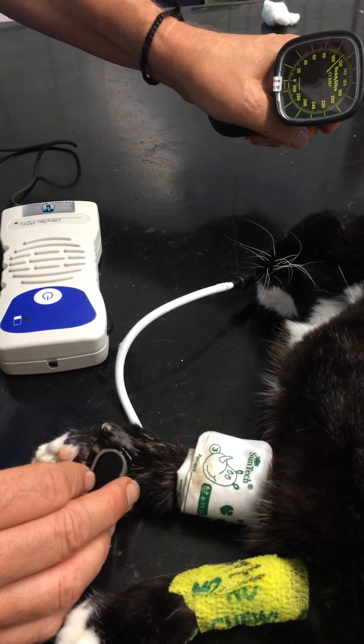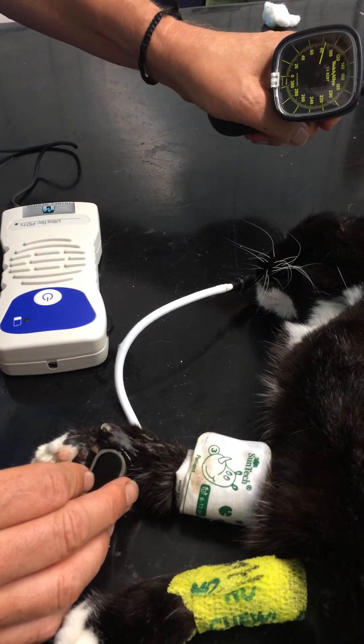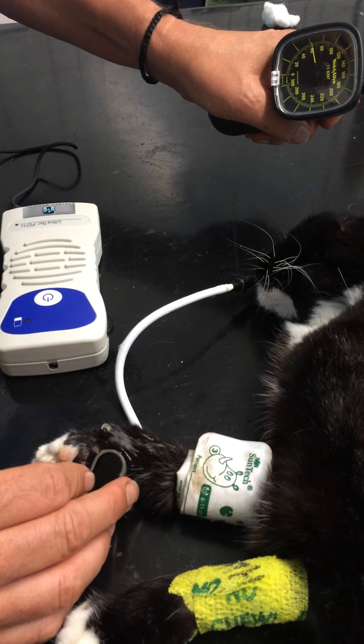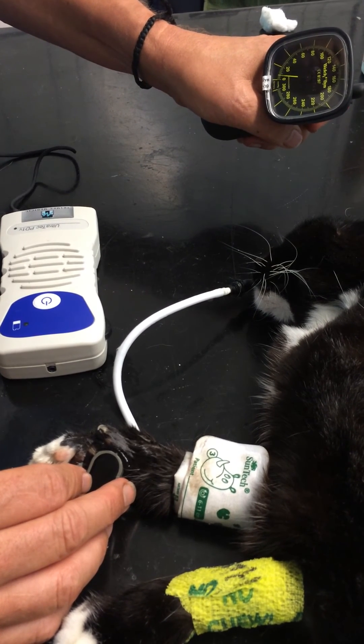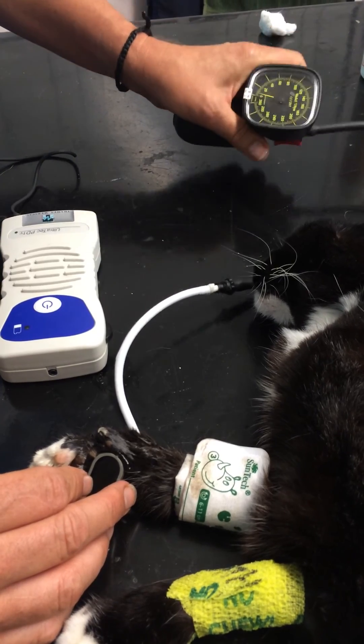The pulse is disappearing at about 70 and, lo and behold, it's coming back at about 70. Four readings in a minute.